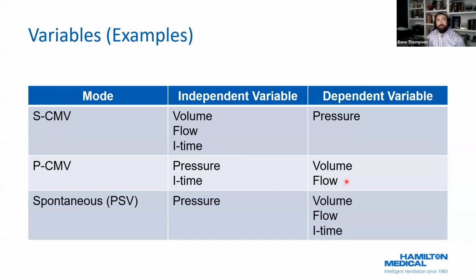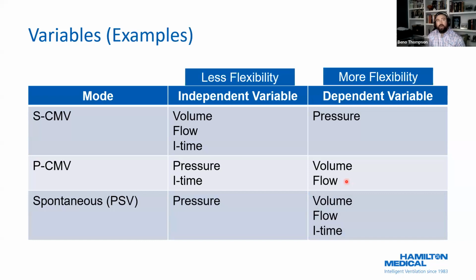And ultimately, you want to go from a mode with less flexibility to a mode with more flexibility as your patient wakes up and starts to become more active, and starts to head towards extubation, right? So essentially, pretty much every mechanical ventilation course that you're going to see goes from a less flexible mode to a more flexible mode.